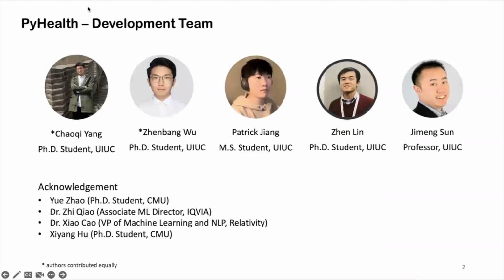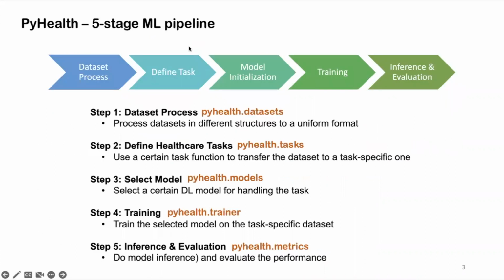As usual, we will first present our development team, and these are basically the current development team members, and we also want to send an acknowledgement to these other members. So today we are going to introduce our biosignal modeling pipeline.